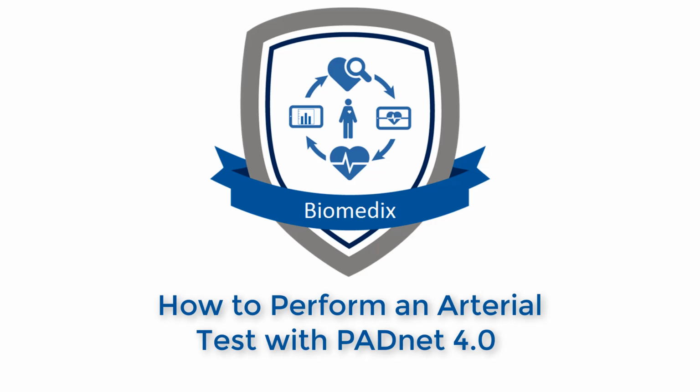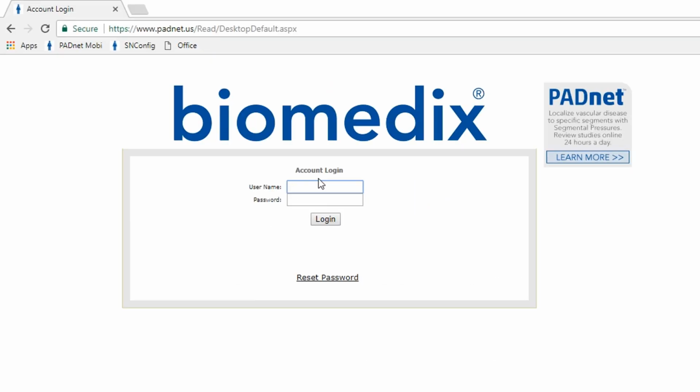Hi, welcome to a brief tutorial on performing arterial tests with the PADnet 4.0. We'll discuss scheduling a patient, performing a complete test that qualifies for reimbursement through Medicare using CPT code 93923, as well as completing and submitting that test.